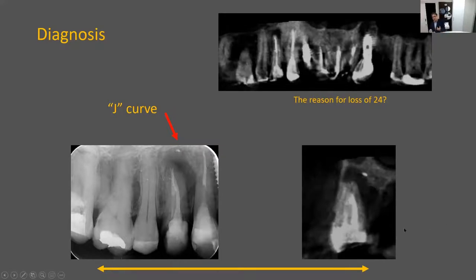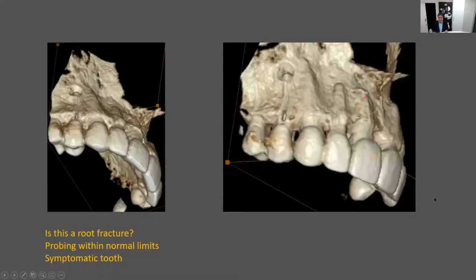I'll get the whole map. I want to see the risk factors. Okay, profiling patients, very important. Again, look at the area of extended lesion here. Okay, this patient won't have an immediate implant. So no way, can't do it. Take it out, clean it, graft it and go back. Rarely would I be surprised if I find bone in there. So that's interesting.